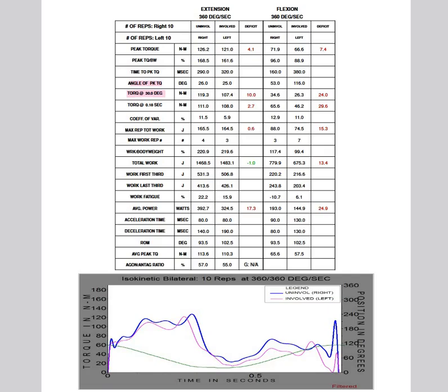So really this is simply saying what is the peak torque at this degree of knee flexion, and it is more relevant, I should point out, for the knee extensors, he says, trying to highlight that area rather poorly, than it is the knee flexors. So when interpreting this value, you're going to want to focus more on the knee extensors.